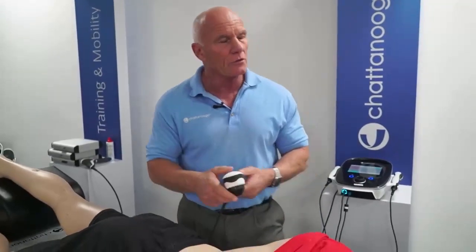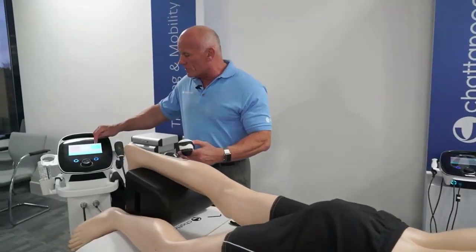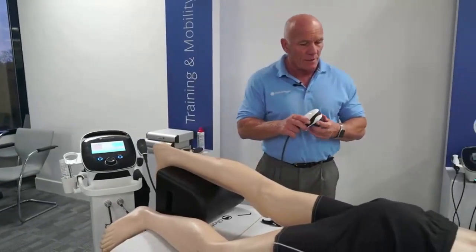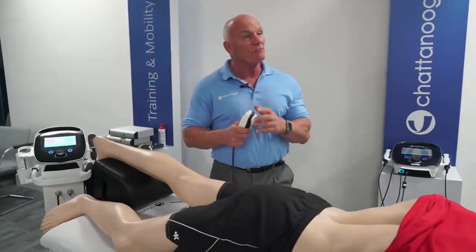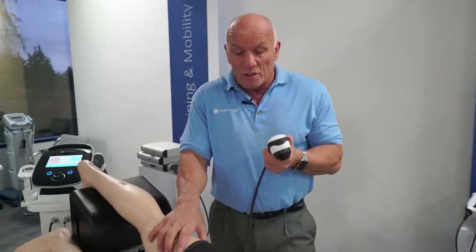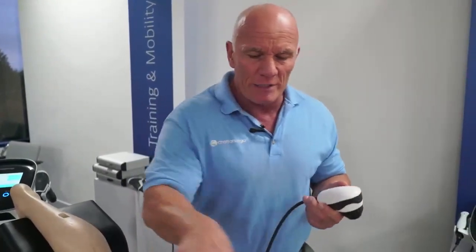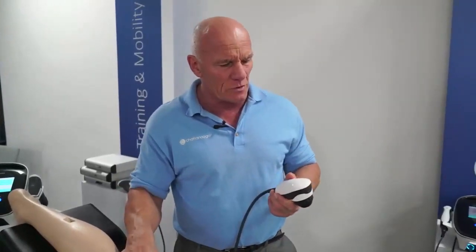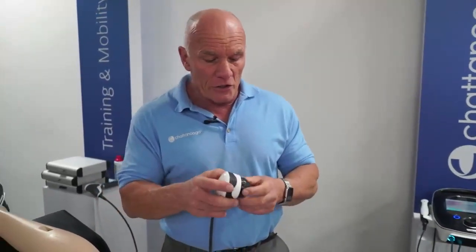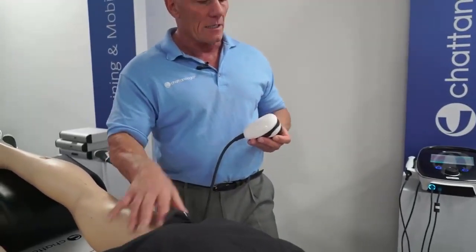If I go back here, if I use a range between 36 and 50, this has the opposite effect. So it reduces hypertonicity. So if I have a patient who comes in with a really tight hamstring, let's say, and we've ruled out there's no strain in there, it's not neural, it's not being referred from the back or the sacroiliac joint, this is protective muscle spasm. Then we can use that range to release the tension off this muscle. It's a very, very nice treatment. Patients love it.